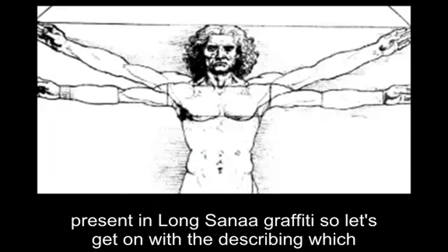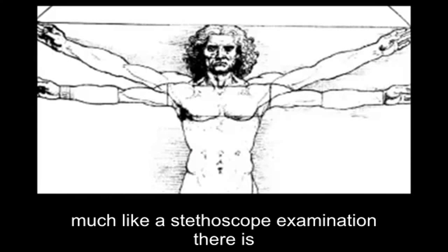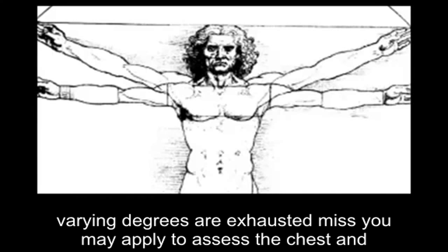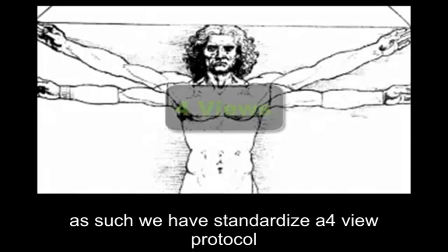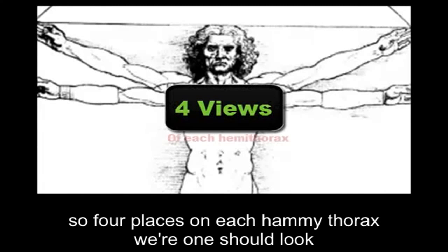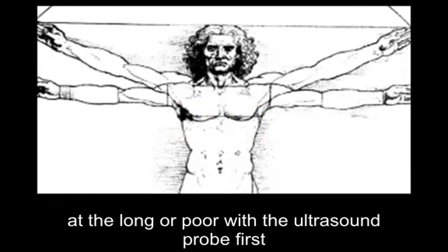So let's get on with describing which places to put the probe to effectively examine a chest. Much like a stethoscope examination, there is varying degrees of exhaustiveness you may apply to assess a chest, and there is a balance between exhaustiveness and efficiency and diagnostic yield. As such, we have standardized a 4-view protocol, so 4 places on each hemithorax where one should look at the lung or pleura with the ultrasound probe.